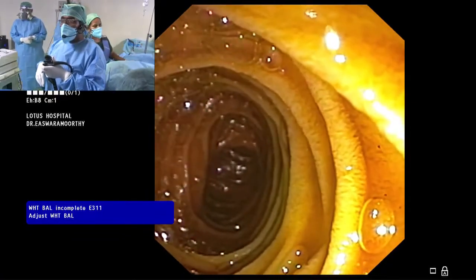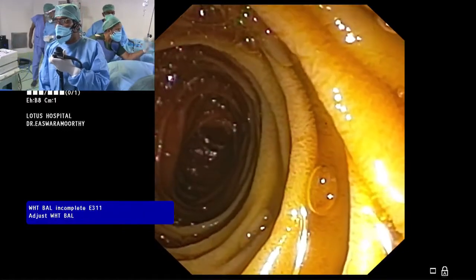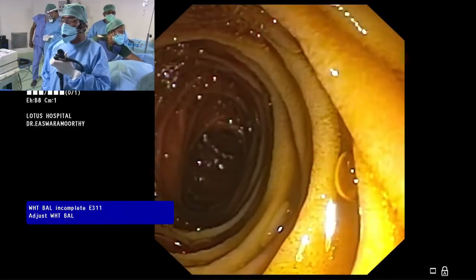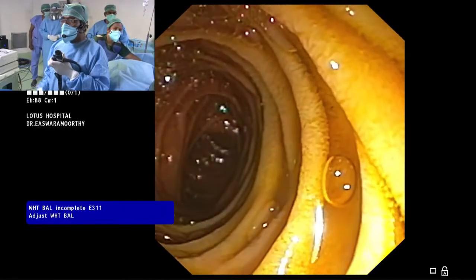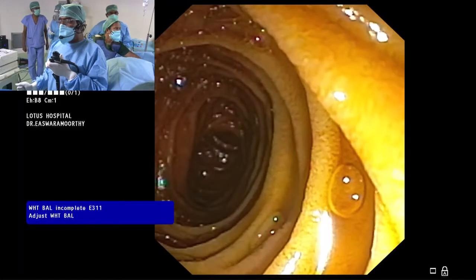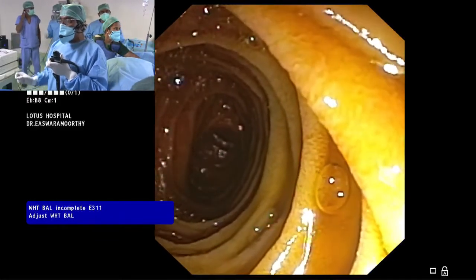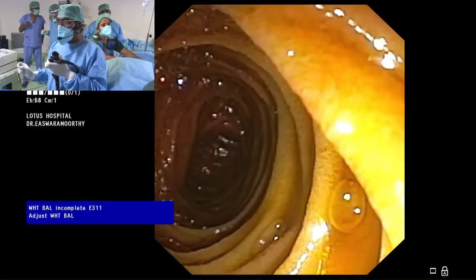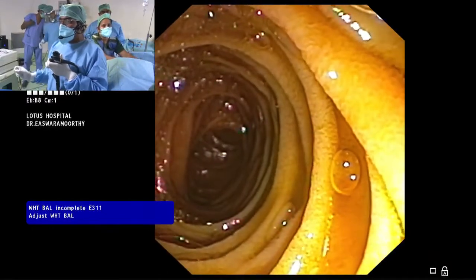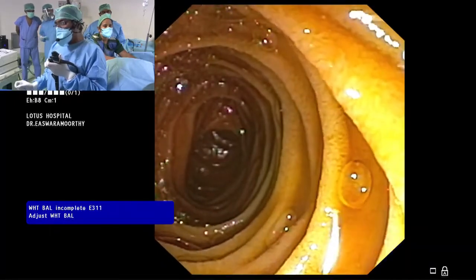So I have a question. Yes, Sir. Jaydeep, yes, fire away. So pre-operatively, what was the imaging suggesting? See, this patient had an ultrasound that showed a bile duct of 8 millimeter. There is no obvious stone. SGOT, SGPT both above 200, alkaline phosphatase 300, gamma GT 500.